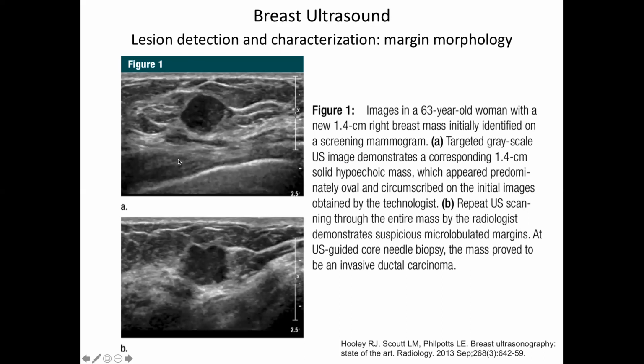That's why the left ventricle with blood in it looks dark, unless you put microbubbles in it. You can inject contrast and see if blood goes into this thing. And you can also do Doppler and see if blood is flowing inside this thing. If it's a cyst, there won't be blood flow in it. If it's a tumor, there likely will be. And also if there's a tumor, there's often a lot of blood flow around it coming into it. So they sometimes do Doppler with it too.